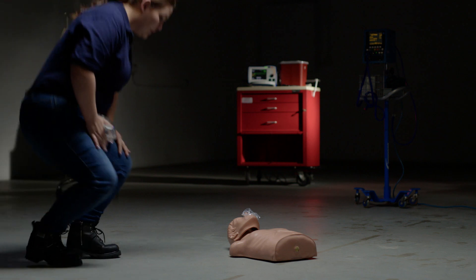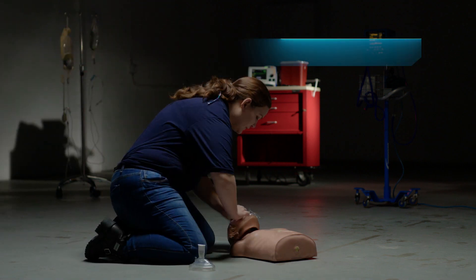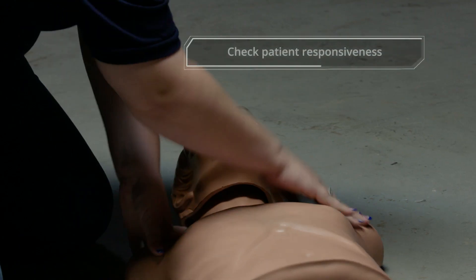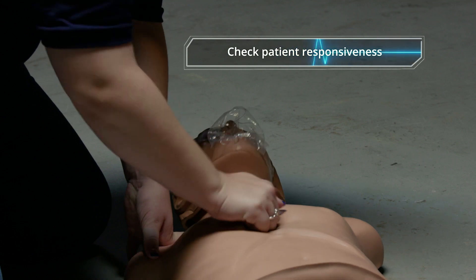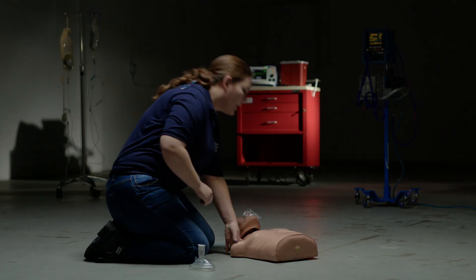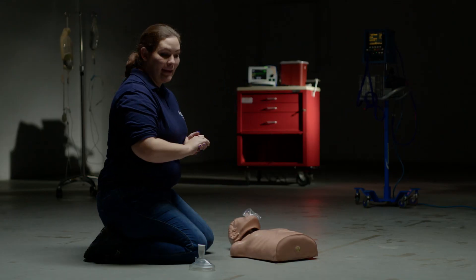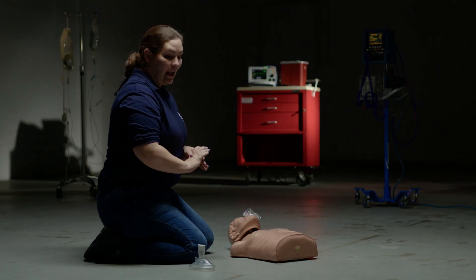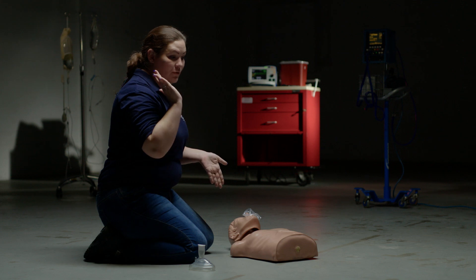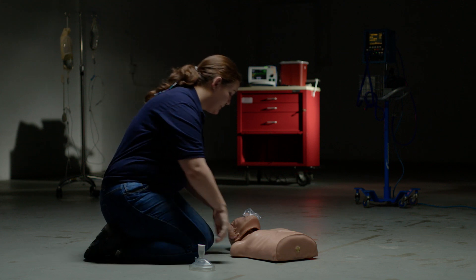BSI, scene safe. Sir? Sir, can you hear me? I need someone to grab the AED and I need to call for additional resources.